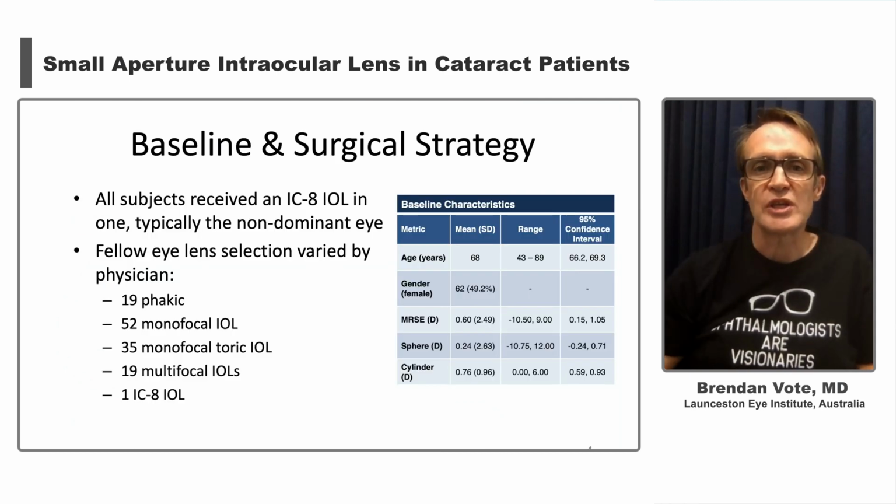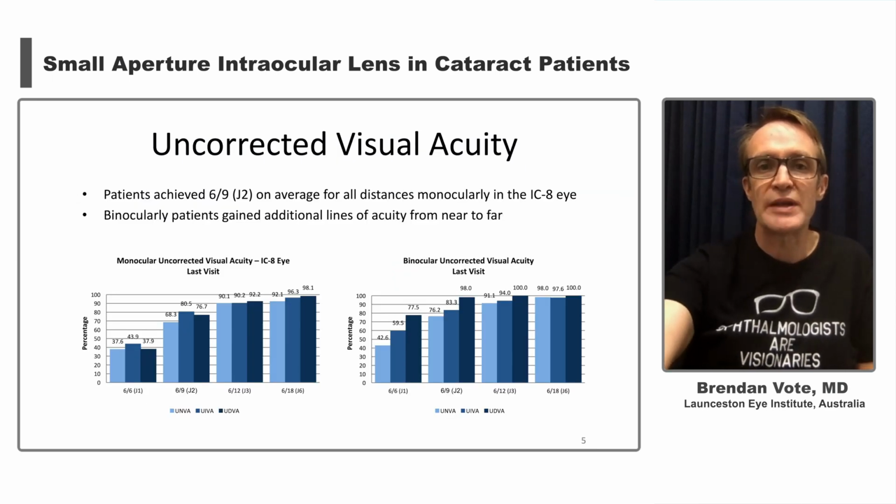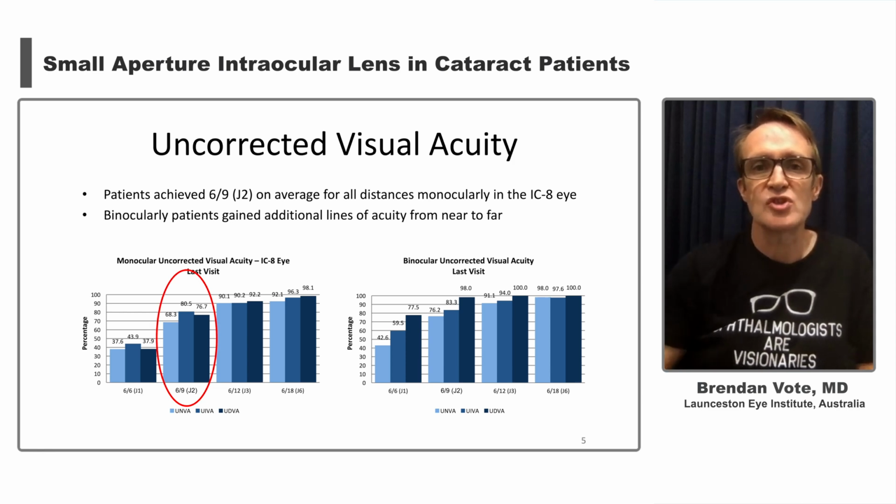All patients received an IC8 typically in the non-dominant eye and typically targeting minus 0.75 diopters spherical equivalent, with the fellow eye managed in a variety of ways, typically targeting emmetropia. Patients achieved 20/30 on average for all distances monocularly in the IC8 eye, with intermediate visual acuity best, followed by distance and then near.